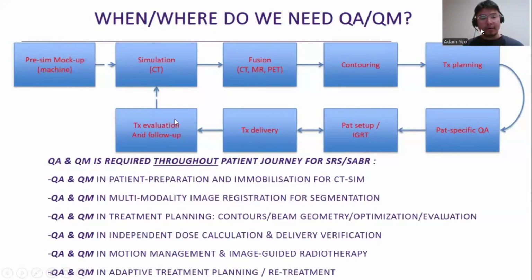This quality assurance, quality management process is crucial, not only that patient-specific QA step here, but throughout the patient journey and the radiotherapy chain.